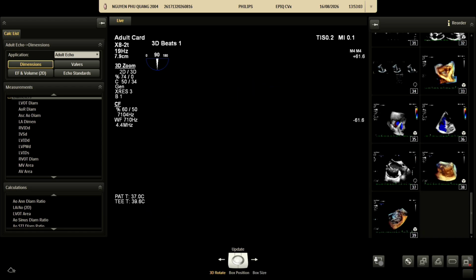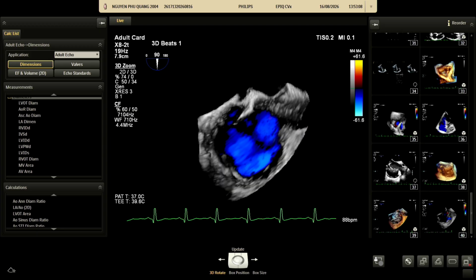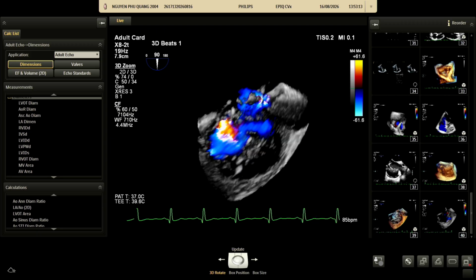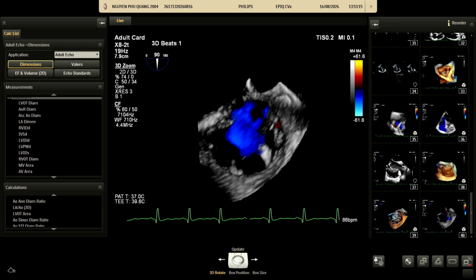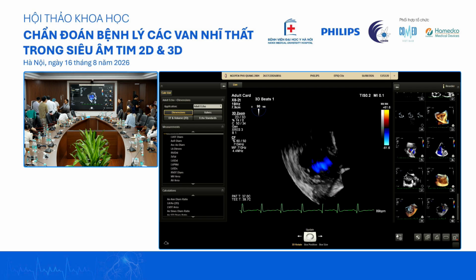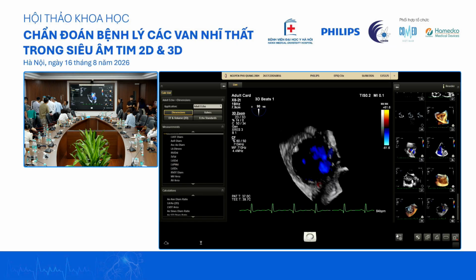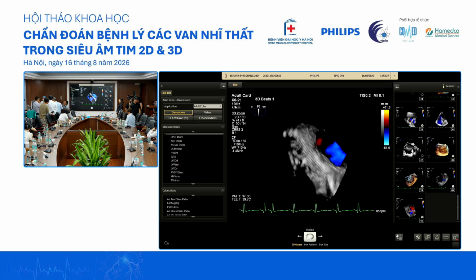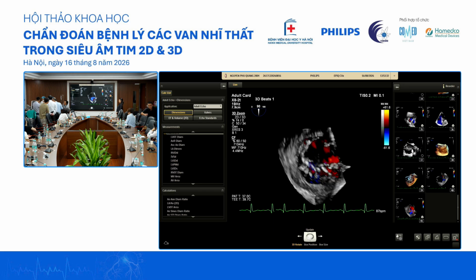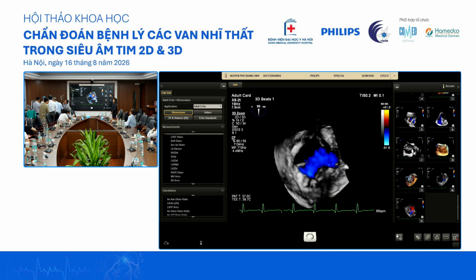Yeah, let's look at the anatomy. So the jet is between the... Where's your aorta? Your aorta is at 1 o'clock, is it? You bring your aorta down to 5 o'clock. Then once you bring it up, posterior is the smaller one. So where's the jet coming from? Septal anterior. Yeah, it's septal anterior.